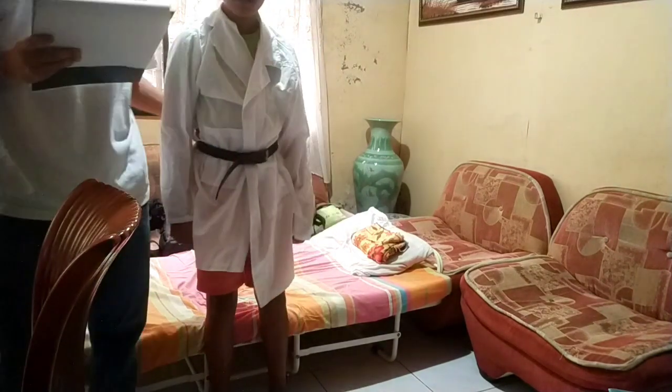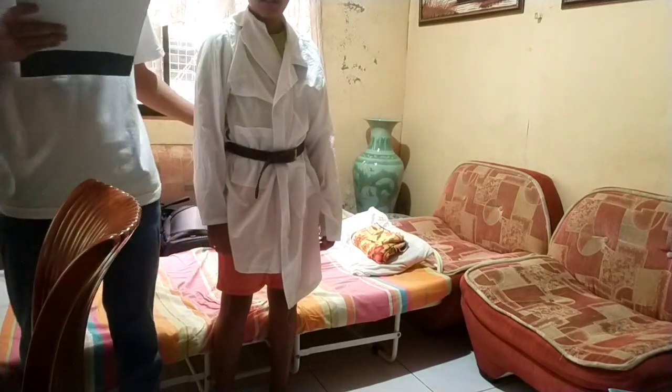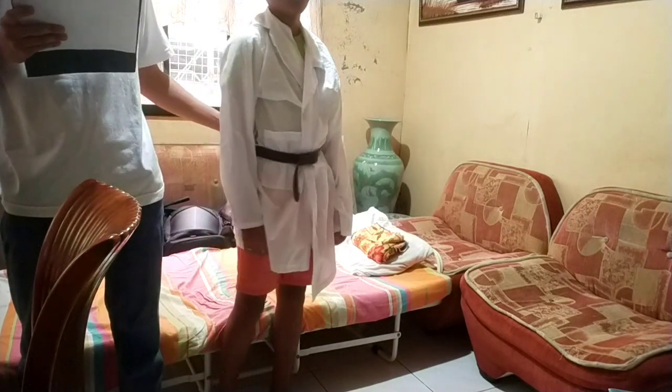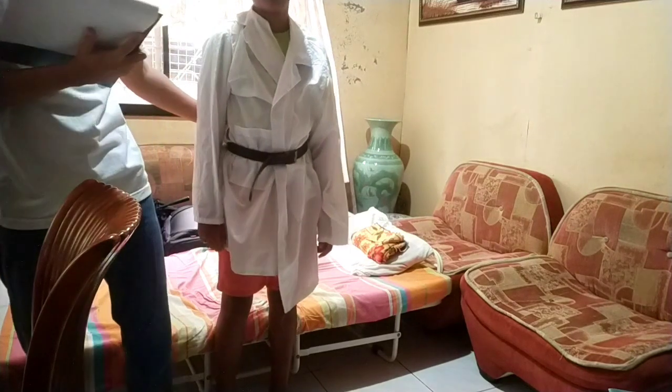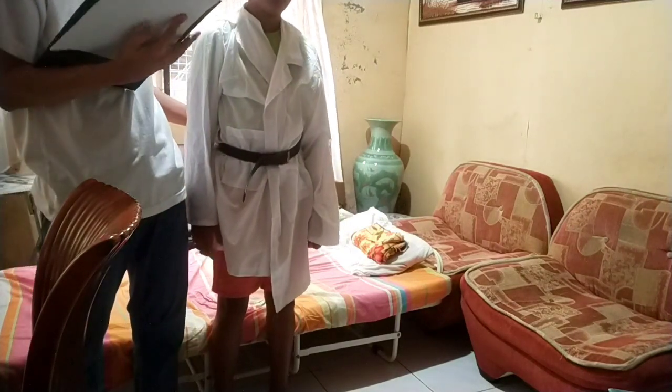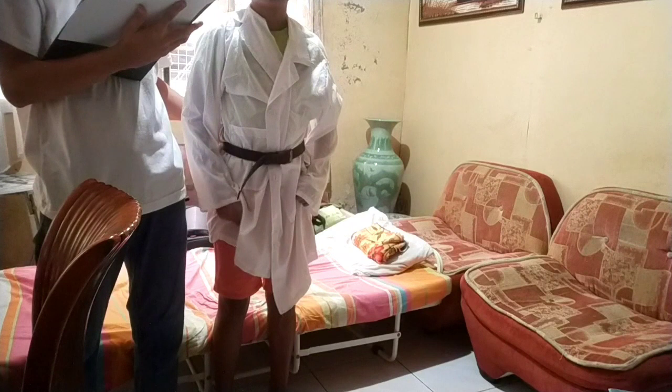So the next procedure is hold the client. Support the client in an upright standing position for a few moments. So, sir, look up, okay? Do you feel dizzy, sir? Look over here, sir. Thank you, sir.